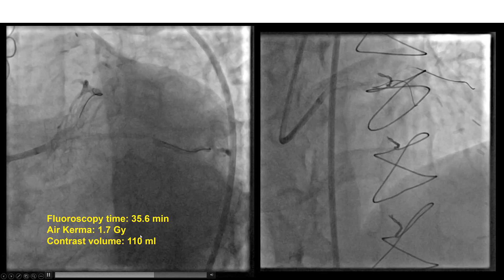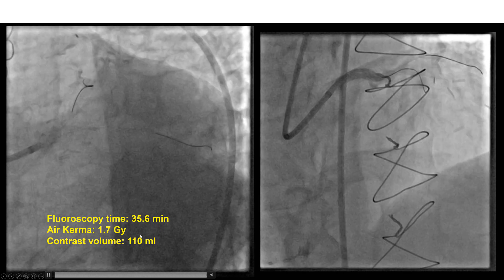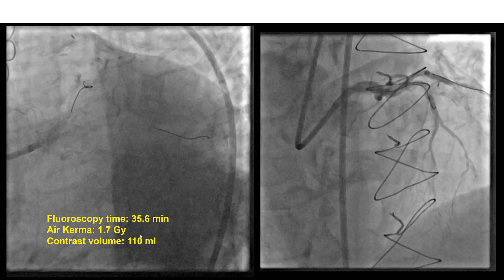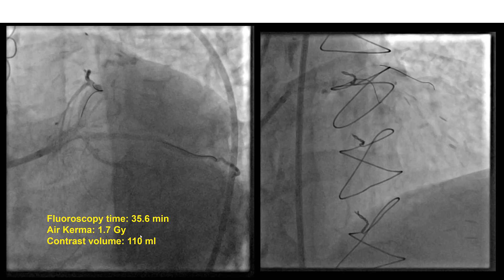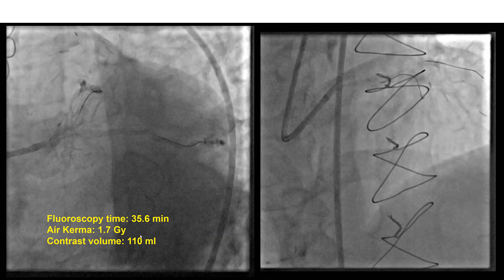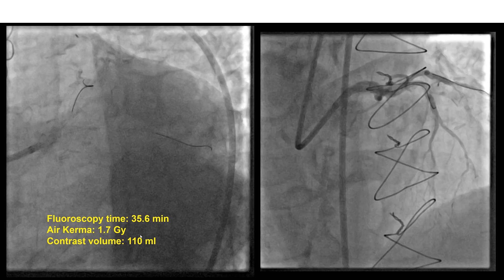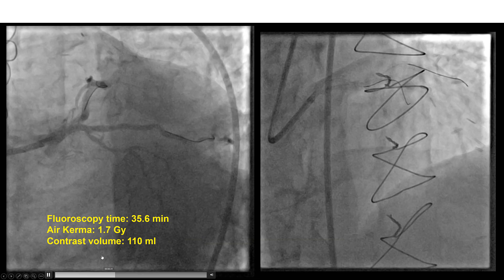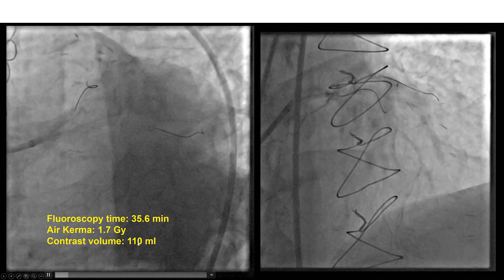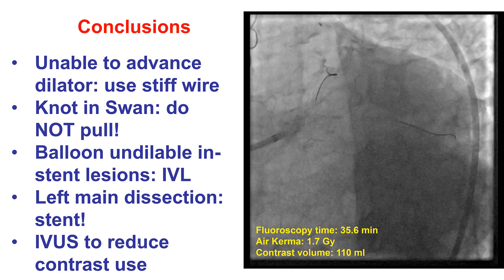We did use 110 ml of contrast, a little more than we would like. Our absolute limit is 4 times the GFR, which would be about 160. So we are still below that, but ideally we should try to keep the contrast volume as low as possible.